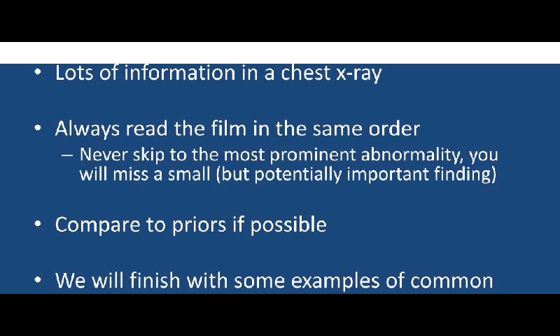Most times patients come to the hospital just to do chest X-rays for medical fitness. At the end of the day, they find something else. So it's very important that you carefully look at these radiographs and evaluate and examine them to ensure that there is no subtle pathology or hidden lesion. Because any hidden one that you don't see can have fatal effects, or the consequences can be detrimental in the future.